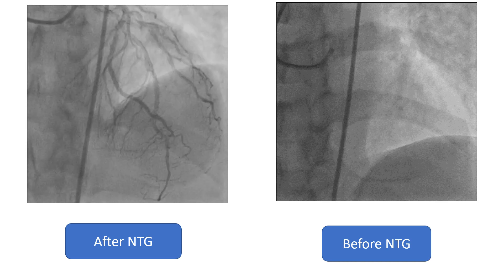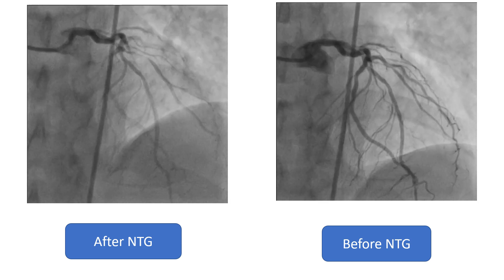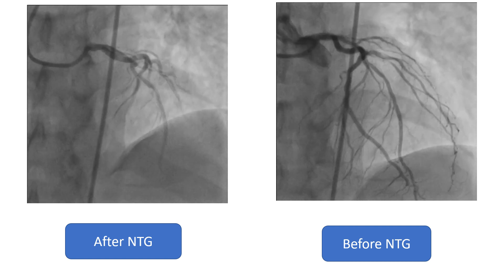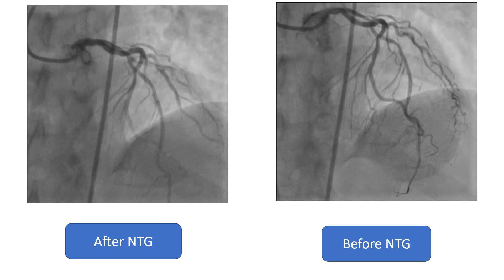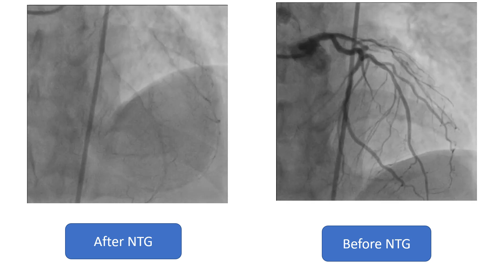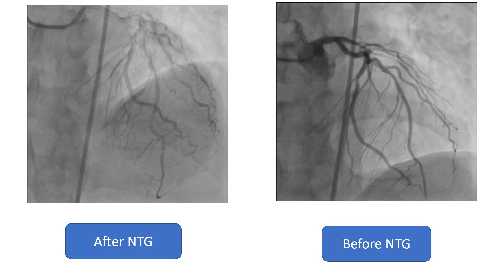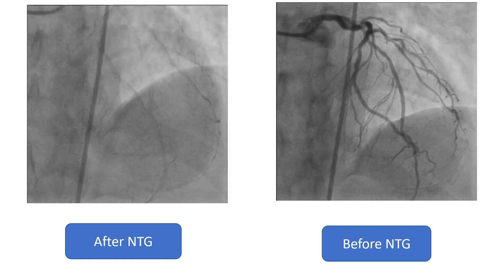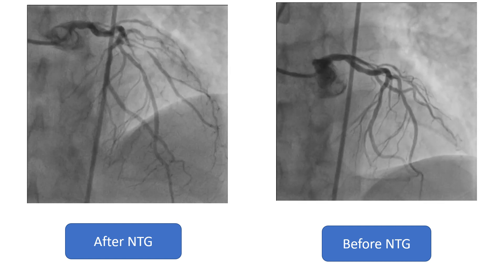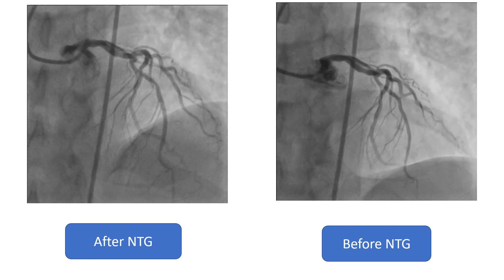Nitroglycerin is very important in coronary intervention. Sometimes it reveals the real size of the vessel. It's clear here that the diagonal is a significant branch when compared to its size before giving nitroglycerin. The diagonal appears to be very large and significant. For the LAD, we needed to do FFR, and it was 0.71, which was significant.